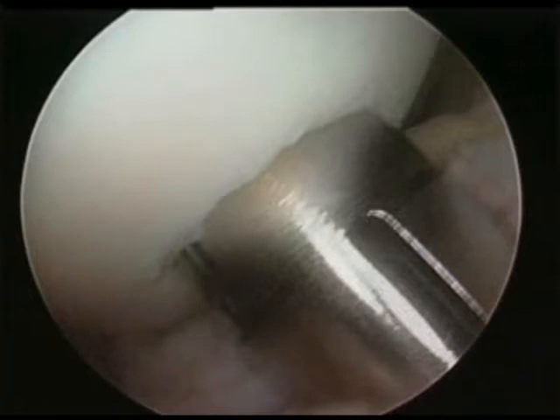The tube harvester has already been assembled. Using a set of Oates sizers, the diameter of the defect has been measured at 8 millimeters.